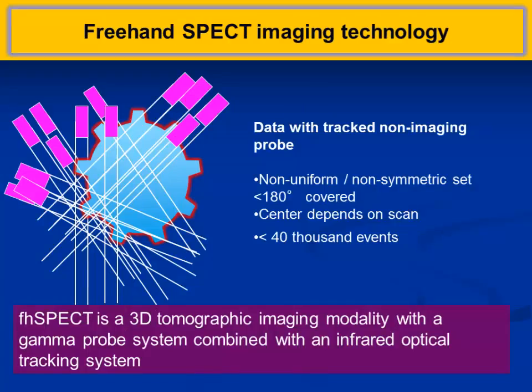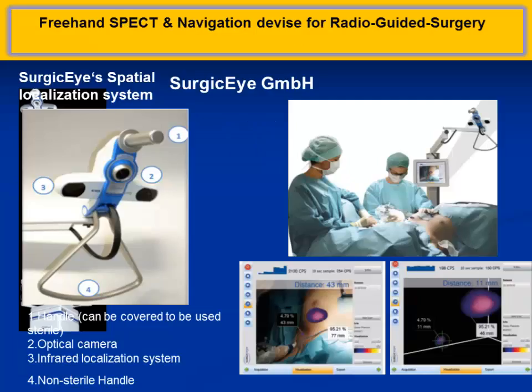This is the 3D mapping which they have. It is exactly a device like this. You inject the patient, I inject the patient, and the surgeon, within 5 or 5-10 minutes, could just localize nodes like that, and he knows exactly where the nodes are. But the only problem is he will miss the dynamic images. So you have to convince the surgeons. I have no problem with them using this in the theater, but it will not replace the dynamic imaging.